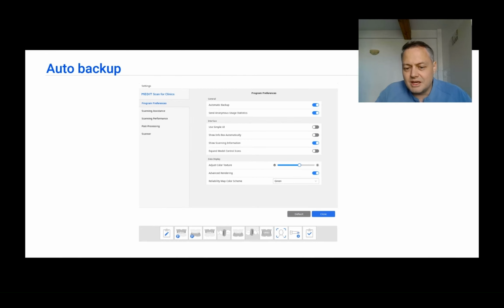For face scan, that symbol for the face scan also stands for a CT load of the patient's DICOM files converted to an STL, but also in that stage, in the face scan and the DICOM stage, you can also import any kind of STL you want, or OBJ, or any kind of file that you can use during your scan. And also you have the additional scan stage that lets you scan anything you want and then correlate it to the case.